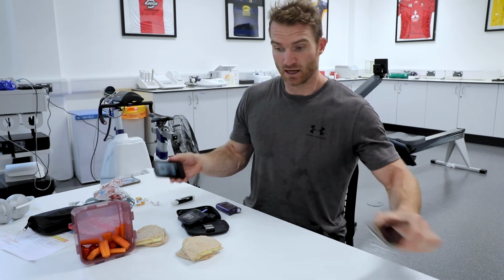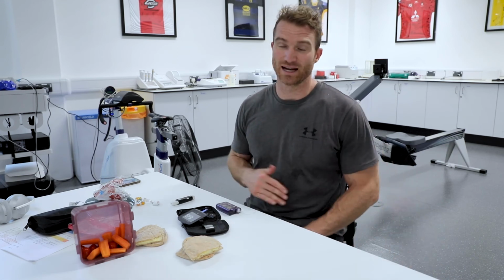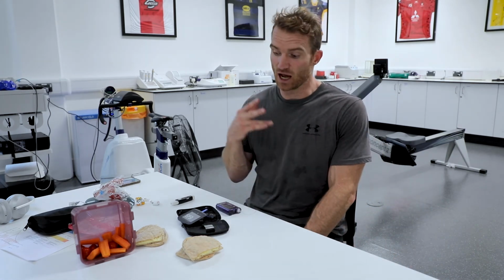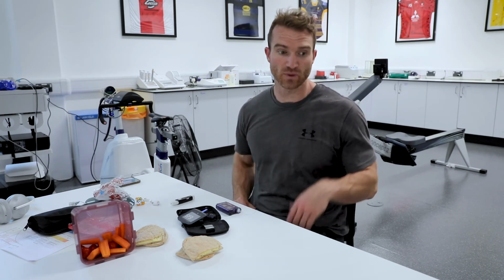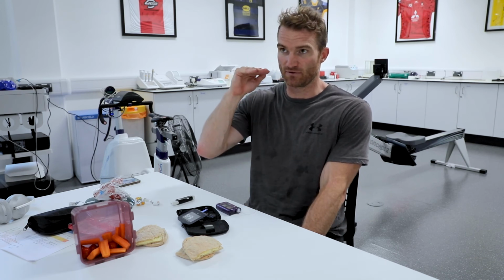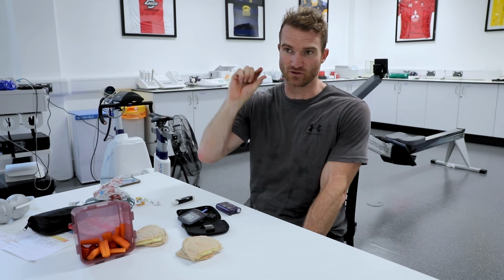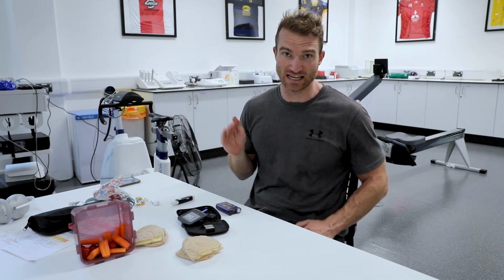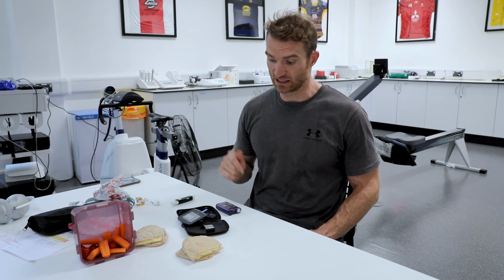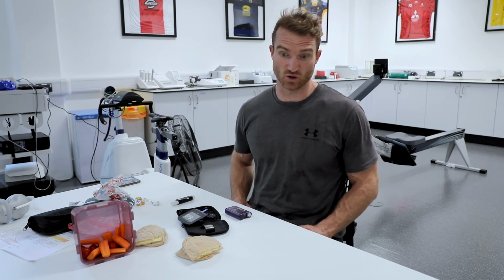So again, these devices are very accurate, but during exercise, they can be 5 or 10 minutes behind. If it's moving rapidly and you're unsure, it can be worth doing a finger prick just so you don't get caught out. And certainly as I did, if you've got an alarm, for the exercise period you need to put the low alarm from 4 up to 5.5, just to give you that extra bit of safety, just in case it's dropping quickly, you're alerted a little bit sooner. Now, I don't want to add any correction in because around 6.6 is a good place to be.